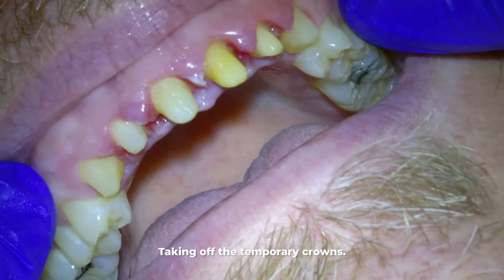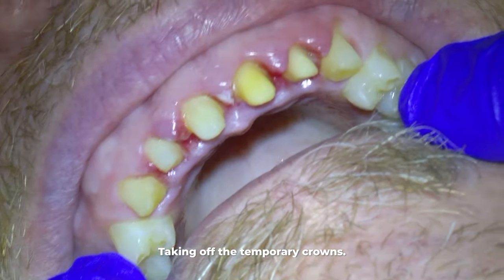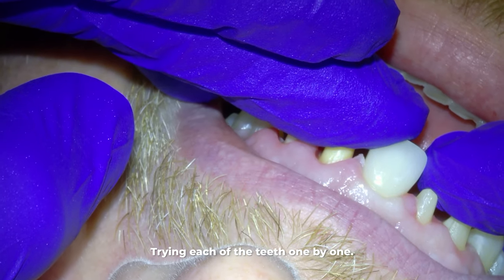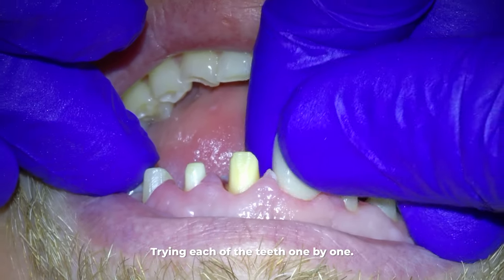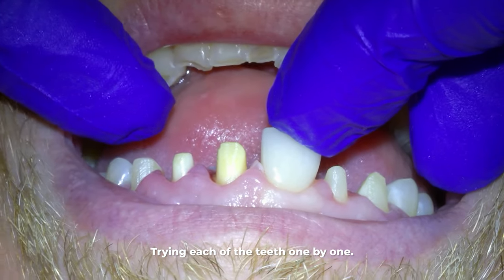Most times the patient will not need to be numb for this appointment unless the teeth are really sensitive without the crowns on them, or if the patient just feels more comfortable being numb for dental appointments. For the majority of this appointment, we try each of these teeth on one by one until we have them all on.